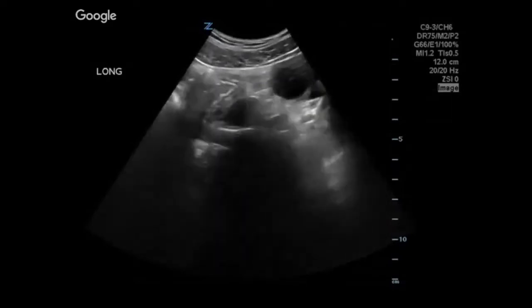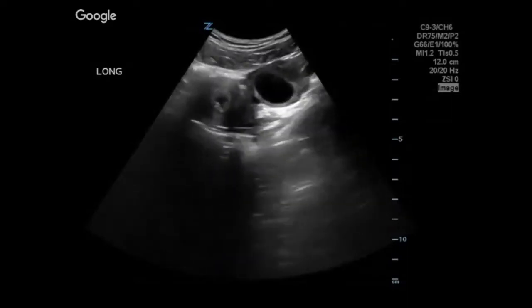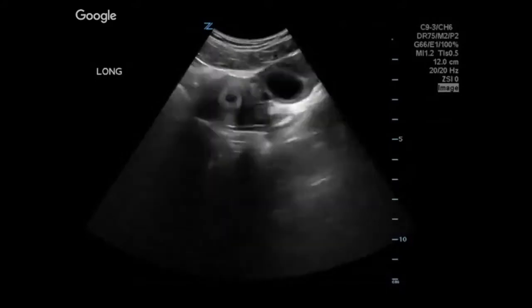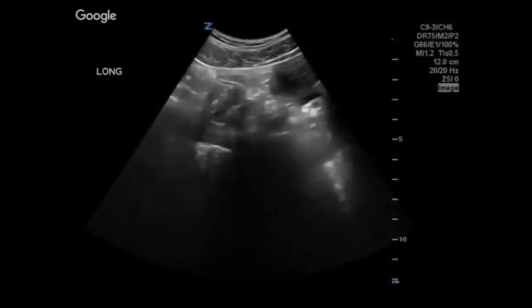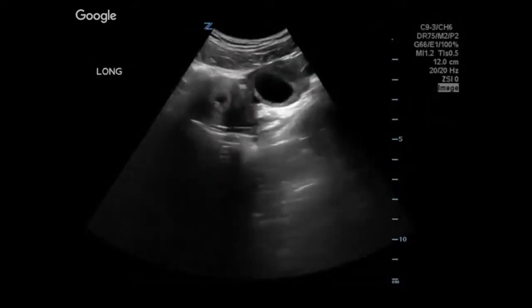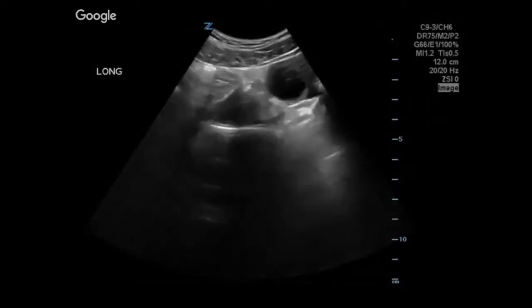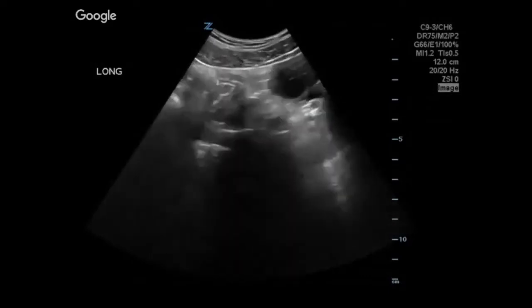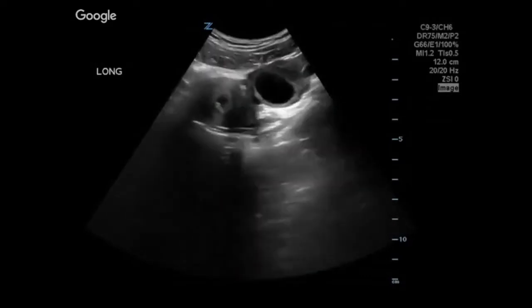Ovarian cyst and fluid in endometrium. That's what they say. Oh, so that's what it is. So it's fluid in endometrium. Yeah, even though you don't see vagina, you don't see bladder. Unless I was doing this scan, I wouldn't know what that was.